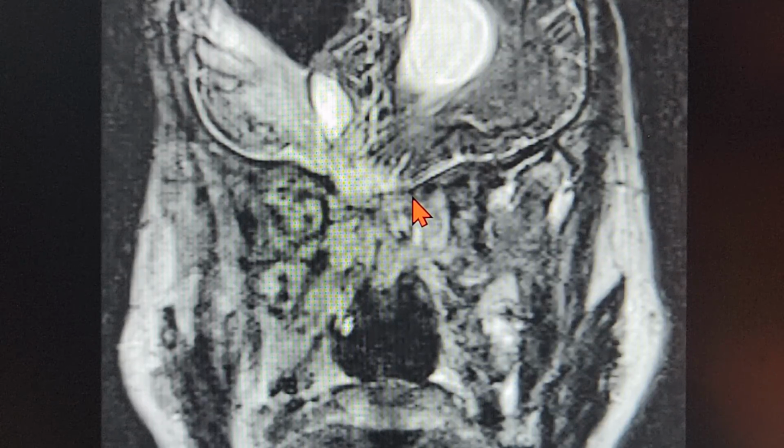But we do need to cross confirm that when we go and operate on the patient, and hence that's the reason why I need to always flush the skull base completely in all cases of road traffic accidents, raised intracranial tension, because if you assume that there's only one skull base defect up there and you seal that defect, all that pressure will reduce and get diverted to some other area which was not active before and may become active the moment you seal that main primary defect.